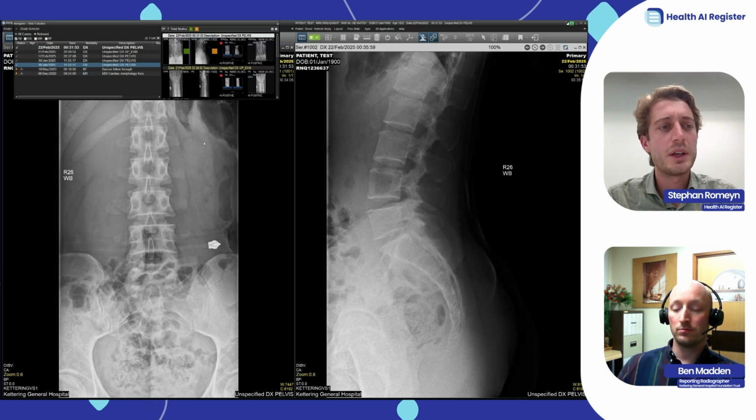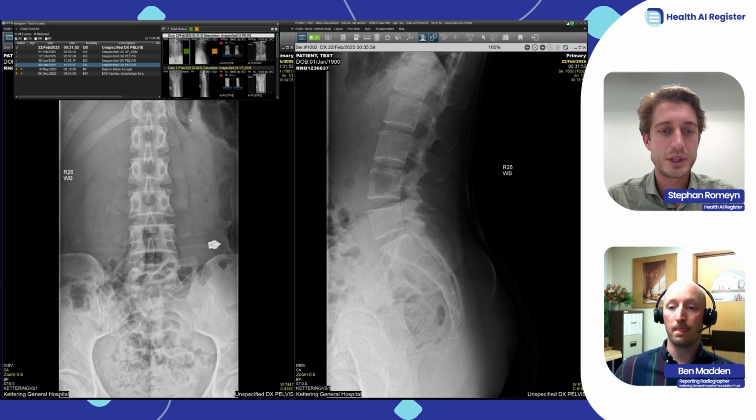How do you work with the ED department in this? So do you as radiographer always look first at the image and then the ED doctor? How do you do that? Especially in the evenings and nights, the ED clinician will be looking at the image first, and then the next day we will pick it up and report it. Usually somewhere between the 12 to 16 hour range, we'll report it.